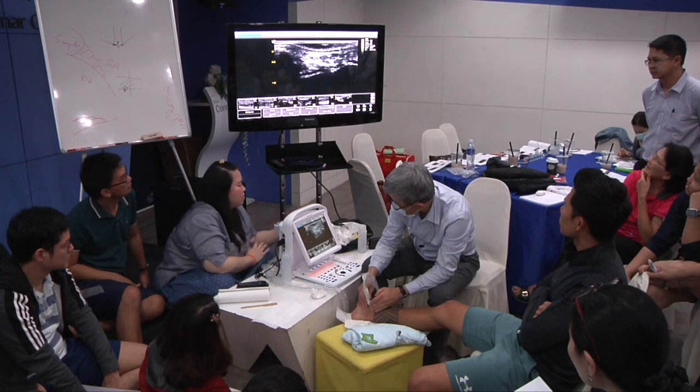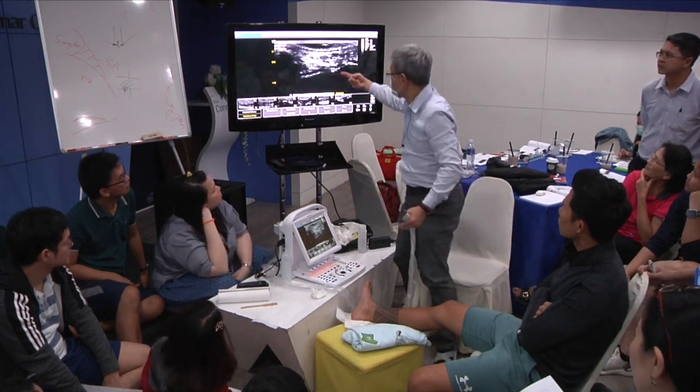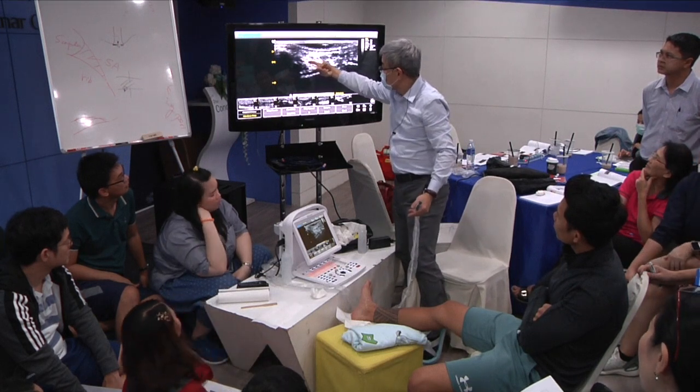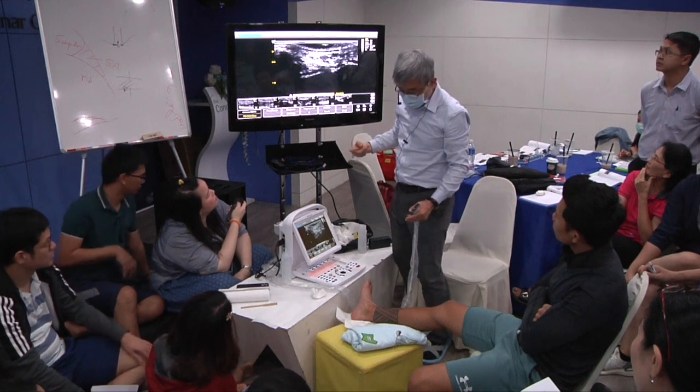Okay, freeze. Okay, you can see the bundle here, right? It's the anterior bundle of the deltoid ligament.